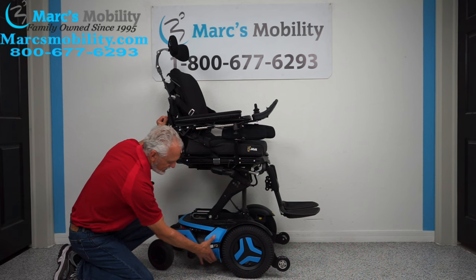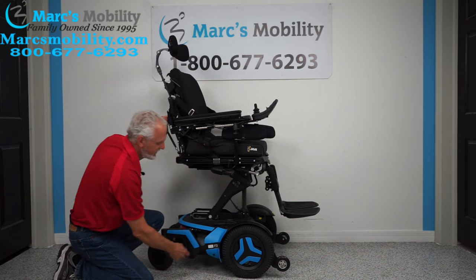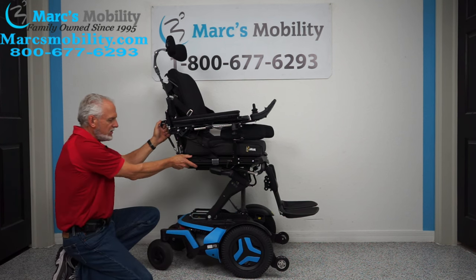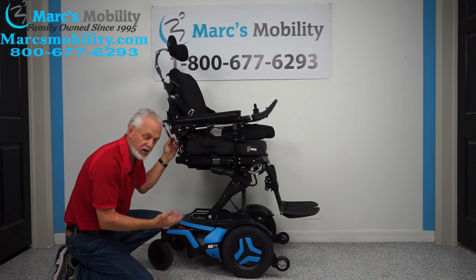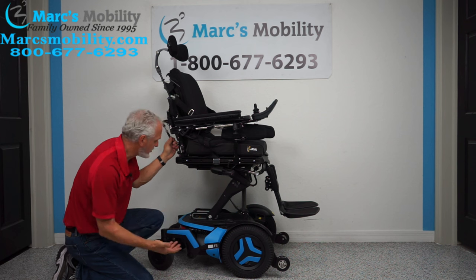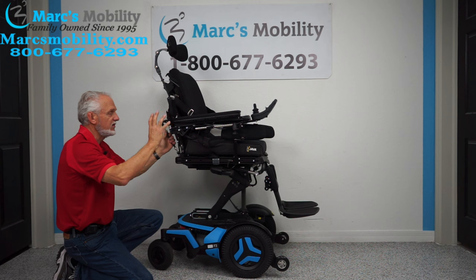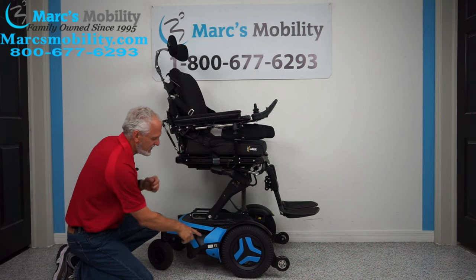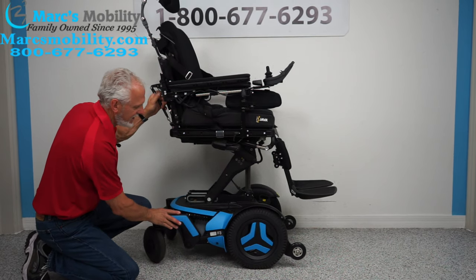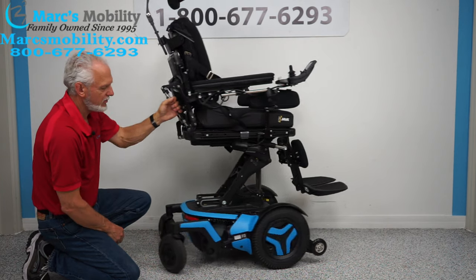There's a motor right here — you can't see it because it's behind this fender, but the motor goes directly to the middle of the wheel. The chair weighs 425 pounds and is not pushable under power. If you forgot to charge the chair and the batteries are dead and need to roll it, make sure the power is off so you have no resistance in the motor. Then take this lever and push it down — that unlocks your wheel. You have to do both motors on both sides, and then you can roll it around.